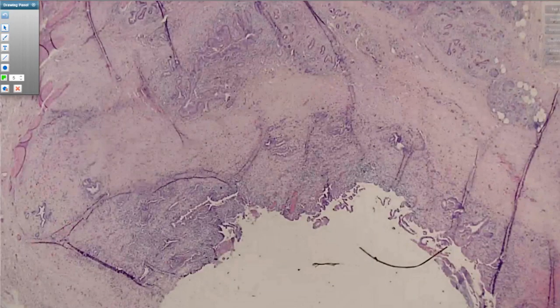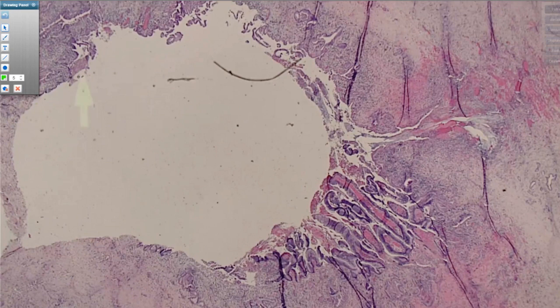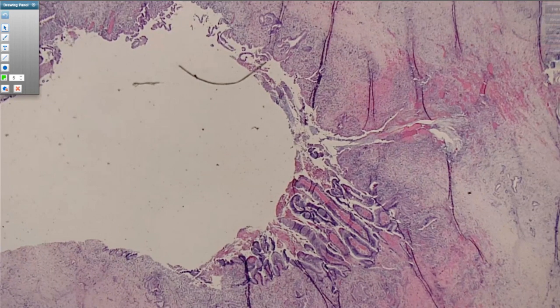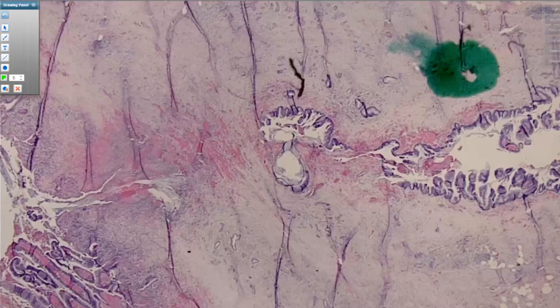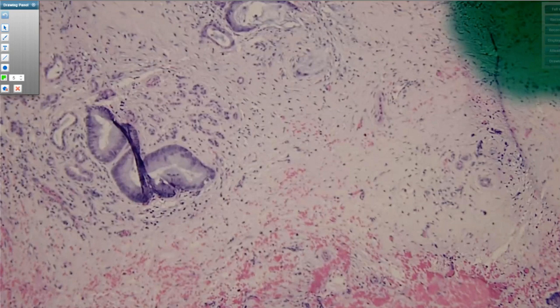But here's another example where you have these big cystically expanded spaces with varying amounts of denudation of the epithelium, lots of reaction around it. You're going to get reaction to that compressive force from the expansion, as well as reaction to your extruded mucin. You'll find little areas like this, with a little small gland partially lined by epithelium. Got 1 or 2 cells right here.